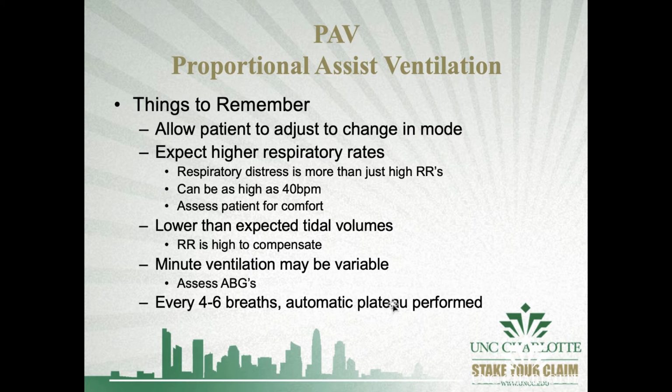Tidal volumes might be a little bit lower, with a high respiratory rate to compensate. This is also because the patient might be switching to this mode of ventilation and actually using their respiratory muscles more, getting more conditioned, and hopefully this will change. And every 4 to 6 breaths, an automatic plateau pressure is performed as a protective mechanism for their lungs, okay?